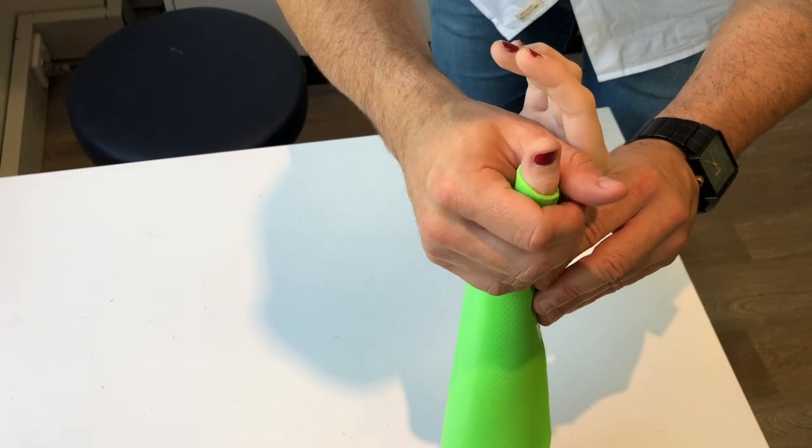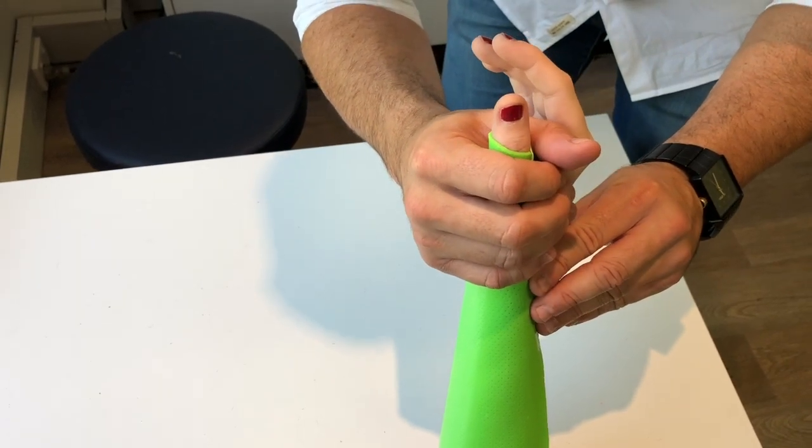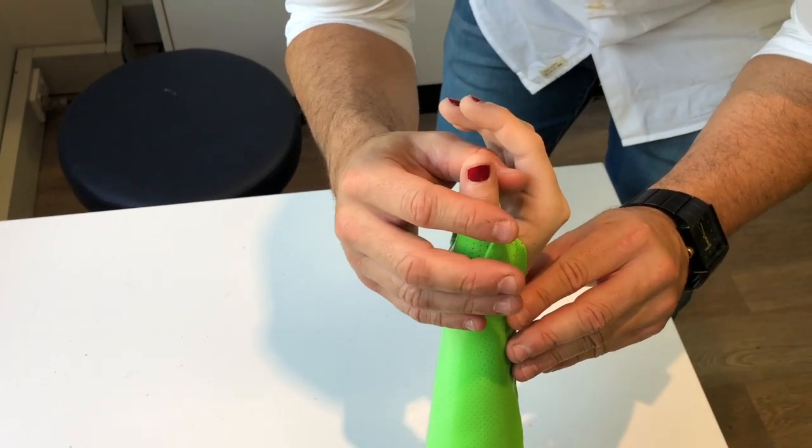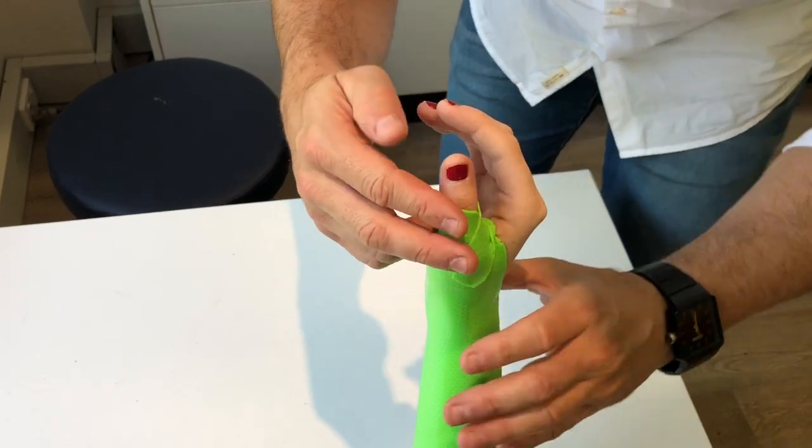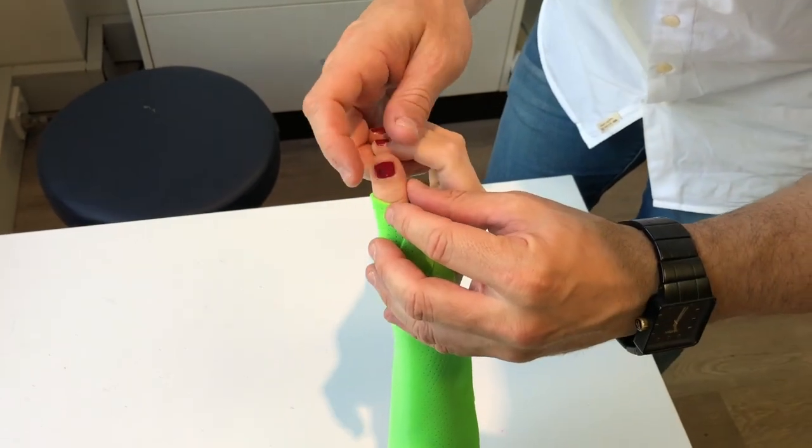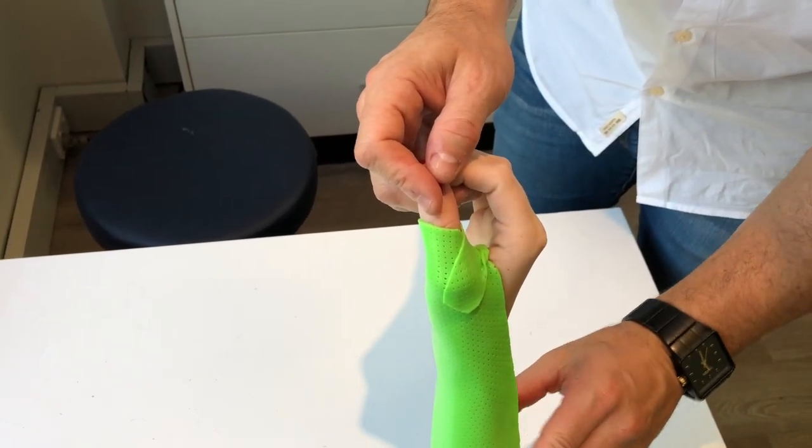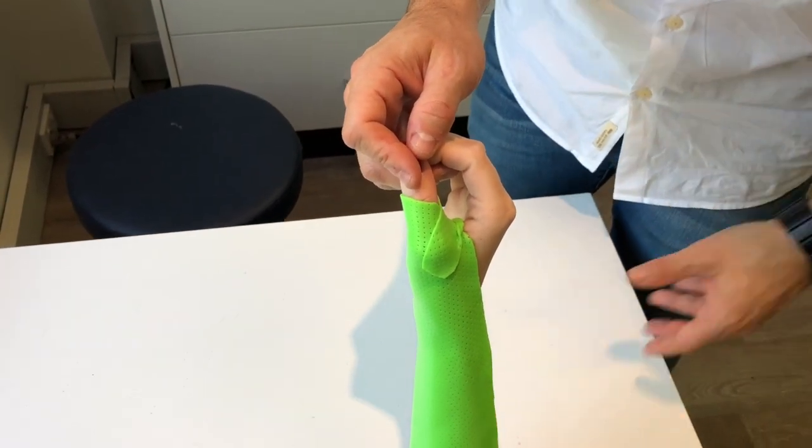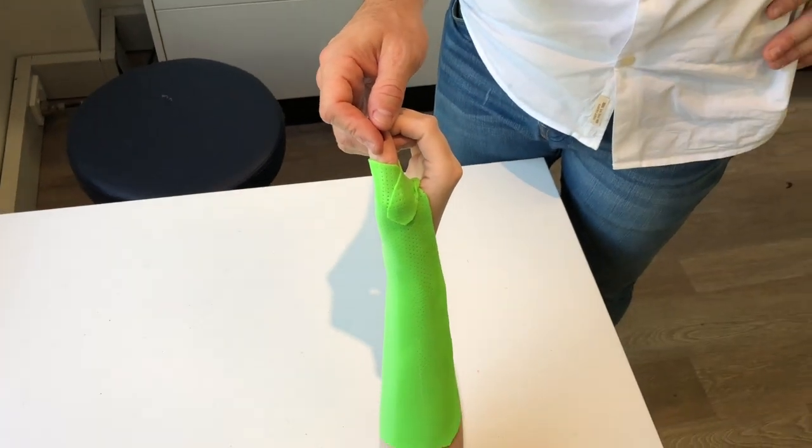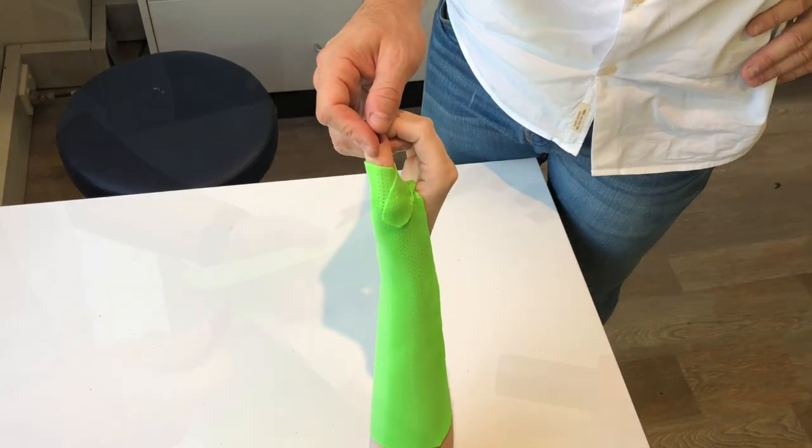Now just be mindful of your patient radially deviating. Bringing them back into that slight ulnar deviation is a much more comfortable position. You can even get them to oppose with a nice big O at the time that the splint's cooling. I like to just hold them in that opposed position.